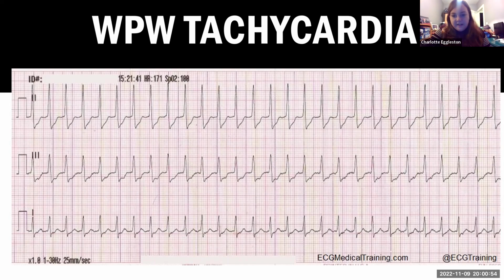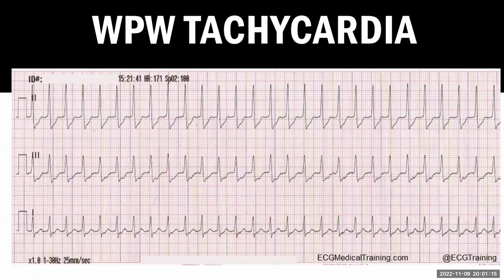Effectively, the only difference is, and it's not the perfect ECG to see it, but I think it's particularly evident in lead 3 here. You've got that upswing, which is called the delta wave. You wouldn't be wrong for calling this a supraventricular tachycardia, and you would treat it in a pretty similar way, to be honest. Although this will probably need magnesium and probably need shocking. But it's technically still a supraventricular tachycardia.